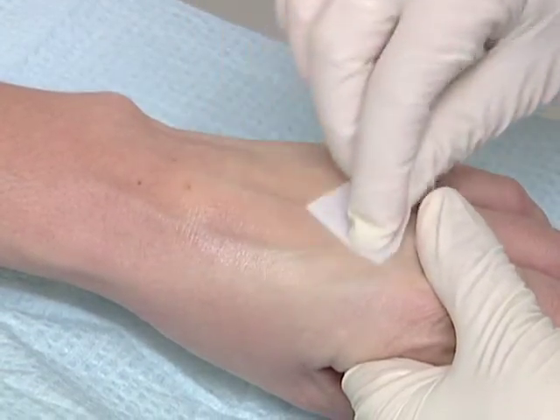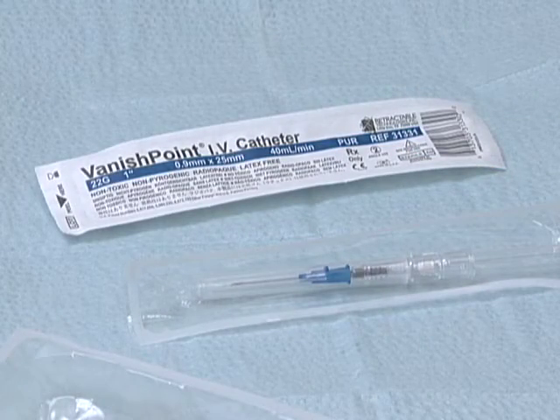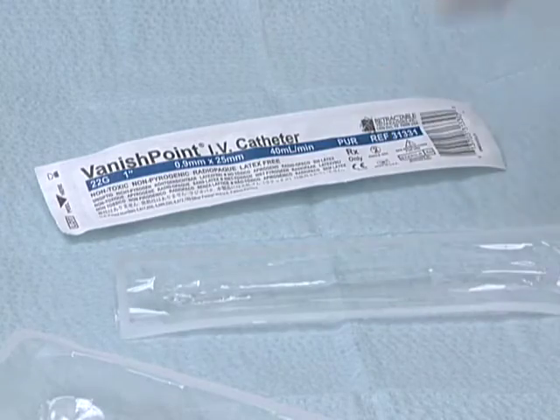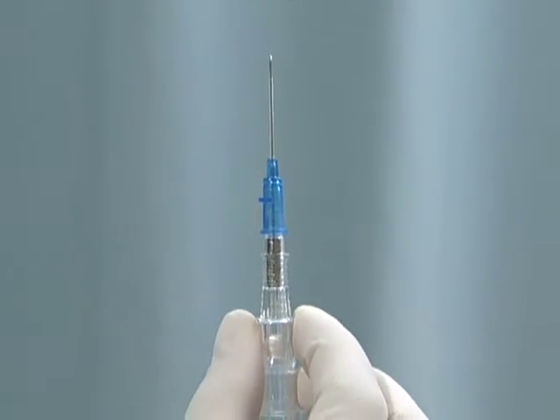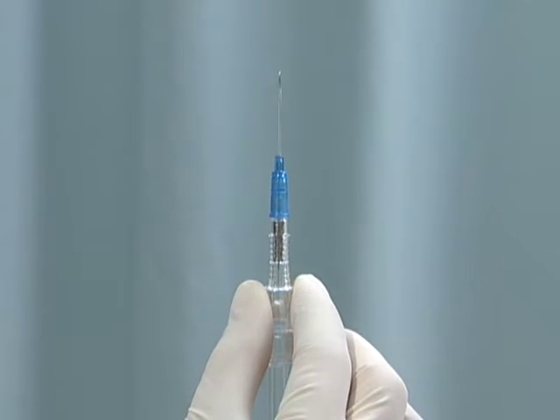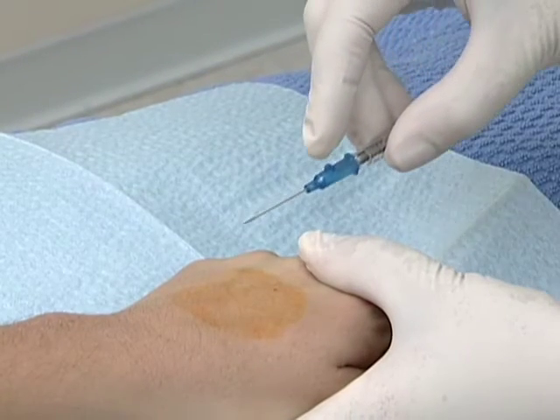The Vanishpoint IV catheter is designed for safety, it is easy to use, and allows for one-handed venipuncture. It contains an integrated safety mechanism that, when activated, quickly and safely retracts the introducer needle, which remains safely retracted inside the housing until disposal.